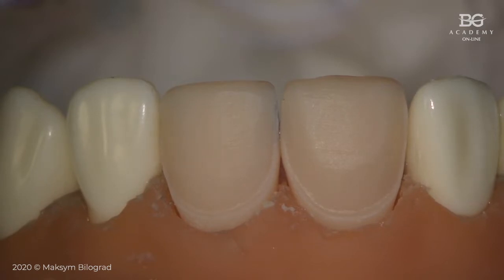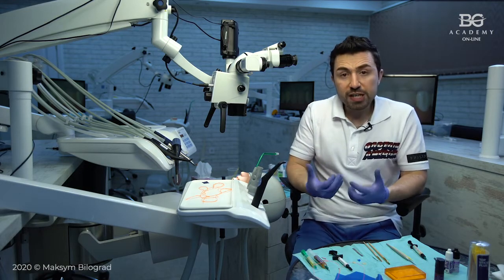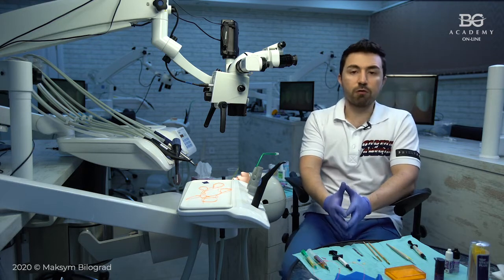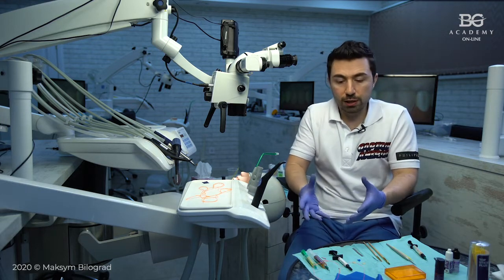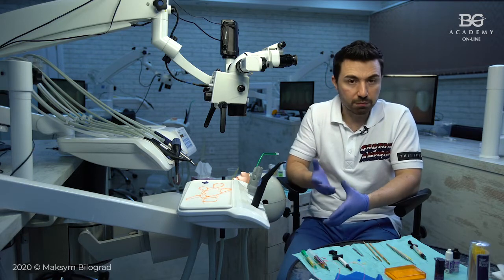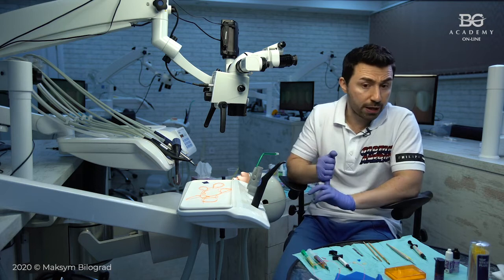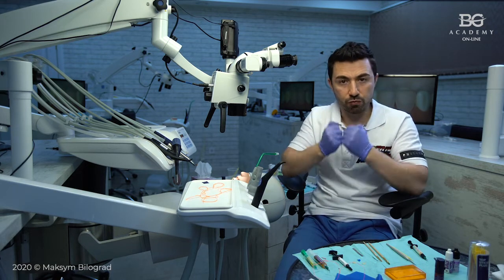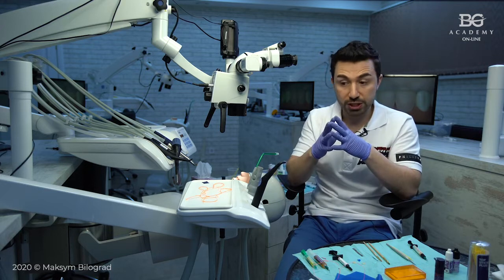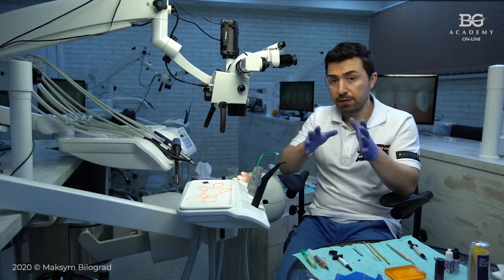And here we have 3 scenarios. In scenario number 1, the pre-adhesive preparation of the ceramic surface can be done in the dental lab. Your dental technician literally can do everything instead of you. He can etch with hydrofluoric acid, and then he can silanize the porcelain veneers. Then you have your ceramic veneer already silanized. You can do the try-in, and then you can bond them.